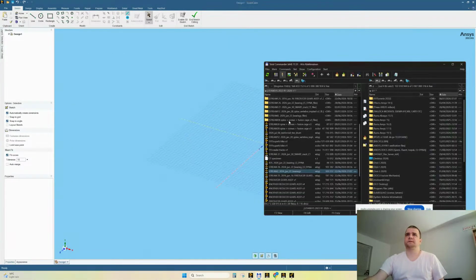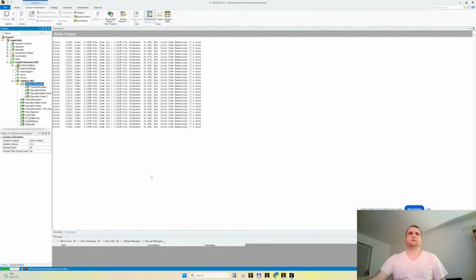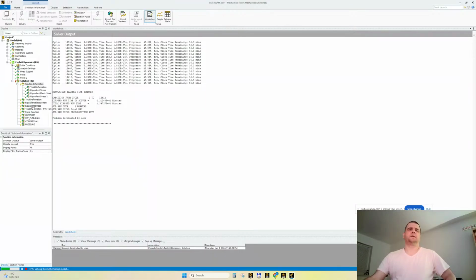So I was here. Do I stop it or not? Let's stop it, even though it looks very nice. But let's make a logical and useful model. And it's another case, you know. We don't need to copy in the utmost detail. We can be creative.